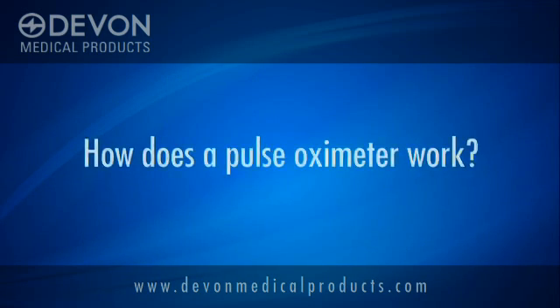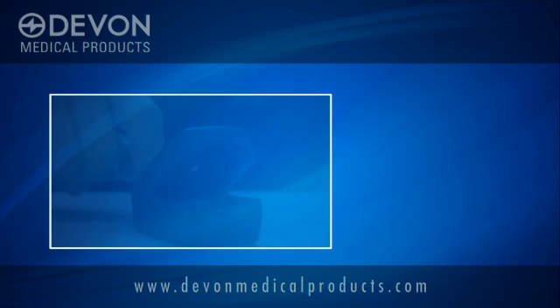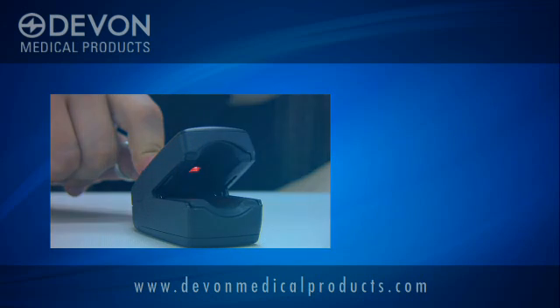Many people wonder how does a pulse oximeter work? To start, make sure that the user's finger lines up with the red LED light seen here. This LED light emits two wavelengths that reflect differently depending on if cells are oxygenated or deoxygenated.